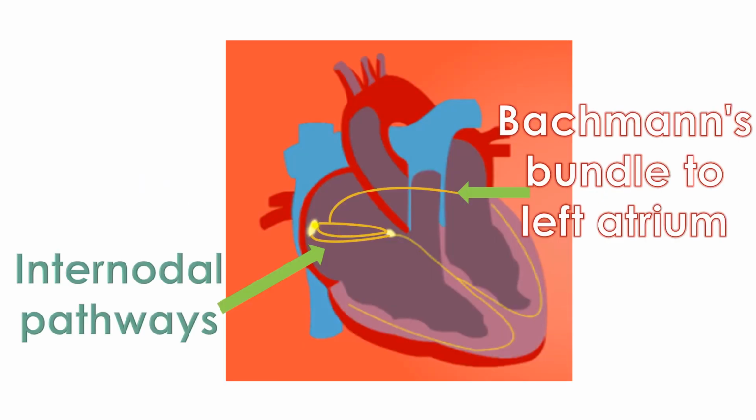Locating the atrial lead at the Bachmann's bundle region instead of right atrial appendage has also been shown to reduce FFRW. The study was in patients treated with multi-site atrial pacing. Right atrial lead implanted at the Bachmann's bundle area in 69 patients was compared to right atrial appendage lead in 70 patients. Bachmann's bundle is an interatrial bundle taking signals to the left atrium.